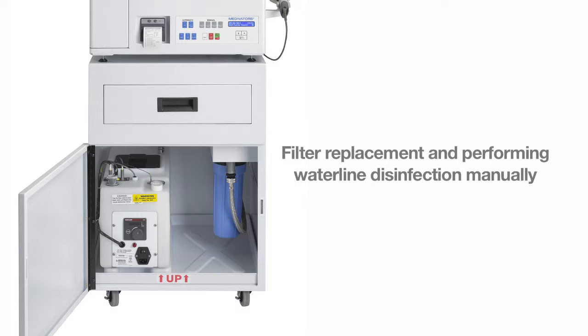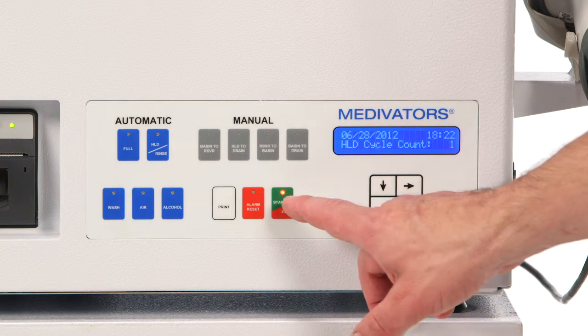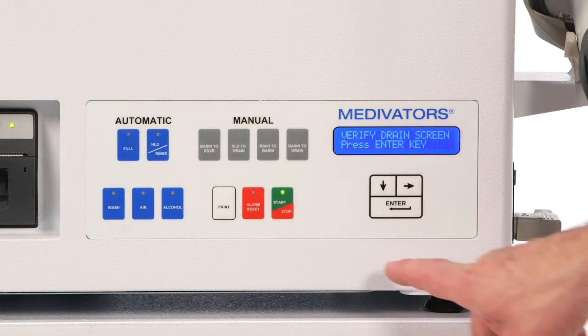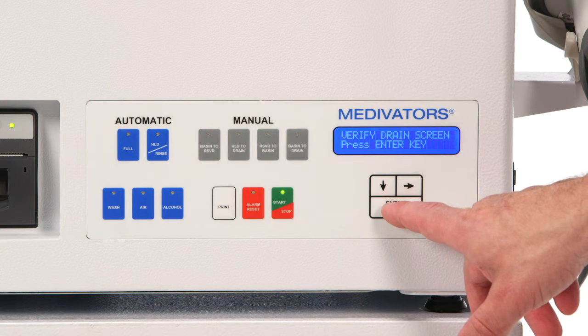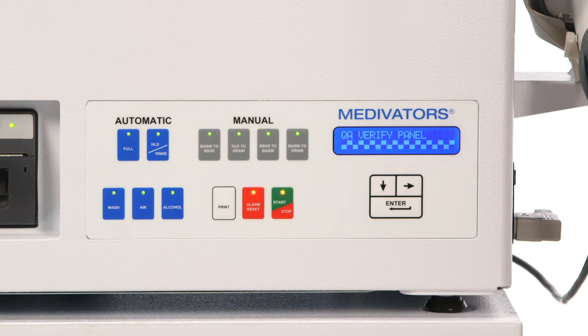Sanitization of the water filtration system and the water lines varies depending upon whether you are manually treating the lines or using a transfer pump. If the quality assurance test has not been run for the day, perform that prior to the water line disinfection or WLD. If you attempt the WLD without running the daily QA test, the CER Optima will force you to do so.